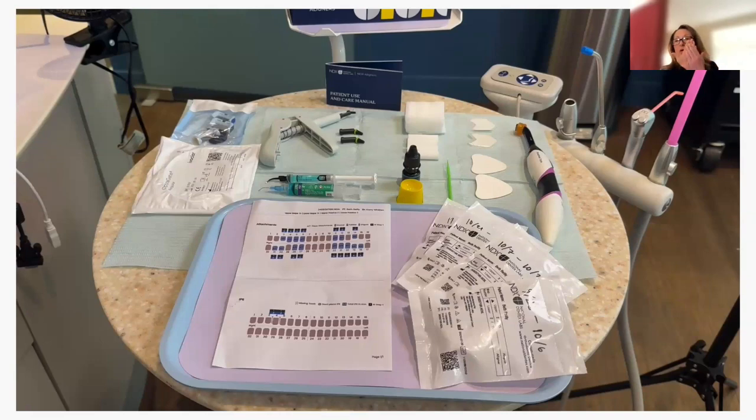So when your aligners go in, it can change the outcome of your treatment because you're putting more lingual pressure on those teeth. Does that make sense for that part? I just really want to make that clear, how important it is that you do not etch the whole tooth.